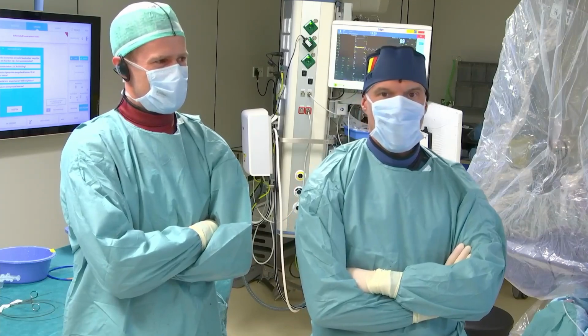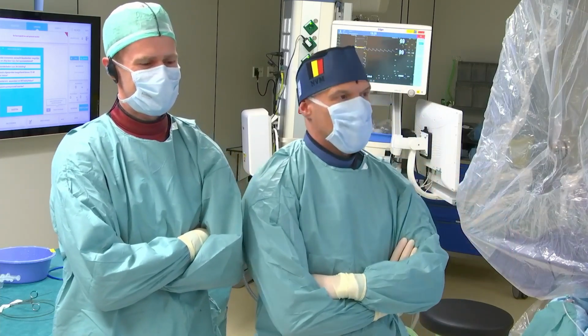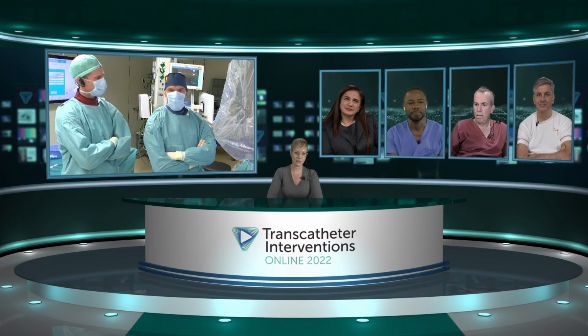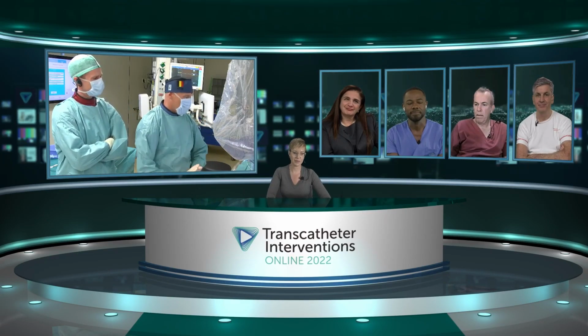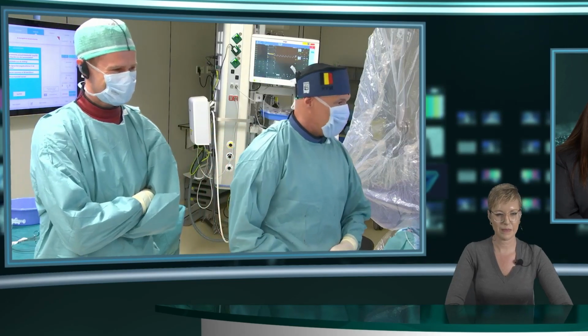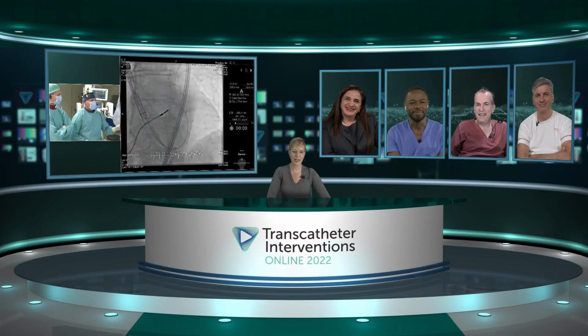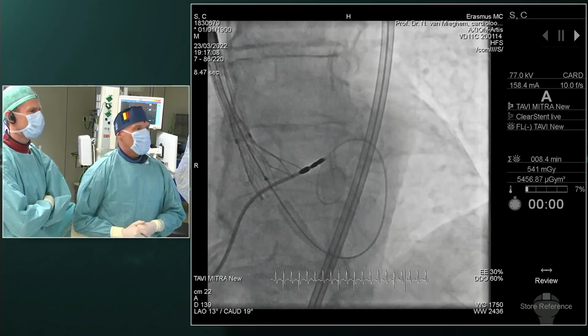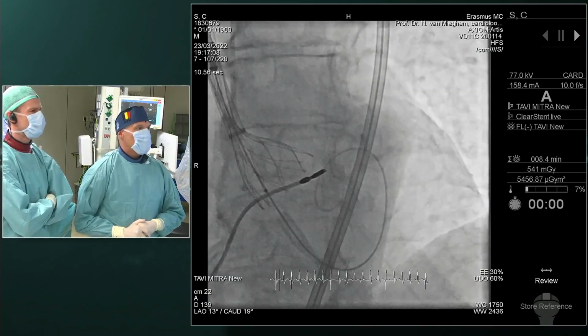All right, Nicholas, we're back to you. Hi, Kendra. Yeah, so I have to say that we finished the valve implant more than 10 minutes ago. Everything is going very smooth. I don't know what happened, but let's briefly show the valve implant. That's a good problem. So this is a very sweet deployment of this Navitor valve that really stayed.